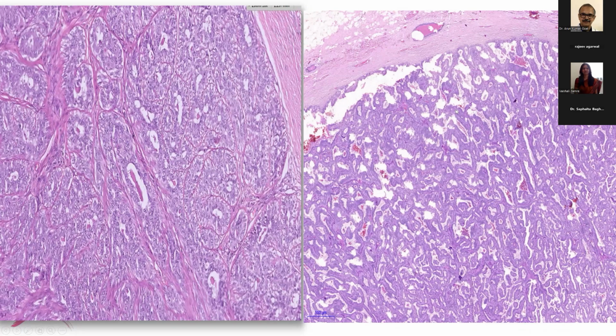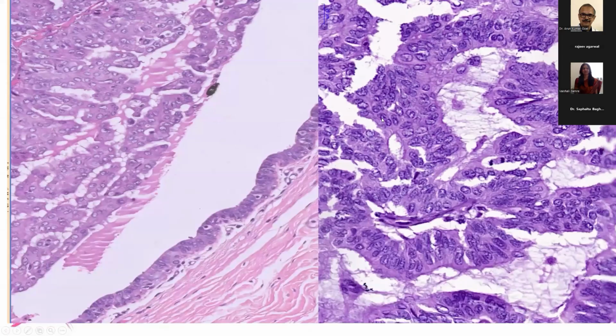So those you know are benign, whereas this one is very, very monomorphic. You have very, very tiny papillae. When you look at the duct wall on the left side, you see a very flattened benign lining, whereas here everything is the same. So you know there are multiple points of attachment in the right side lesion, whereas this lesion has only one, everything is stuck to the wall, but you have a very benign lining.